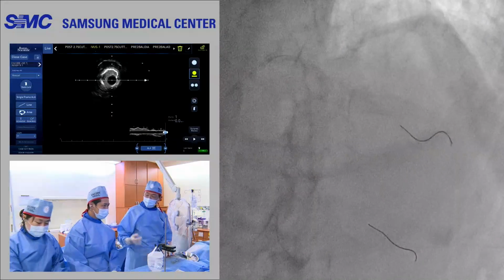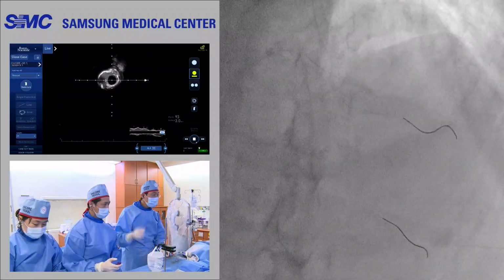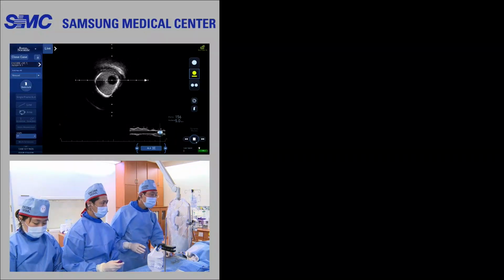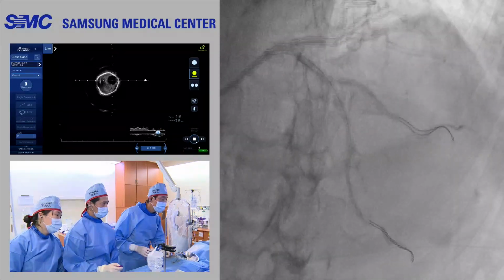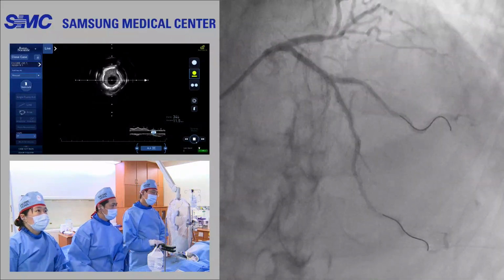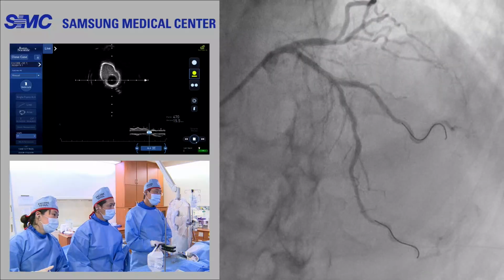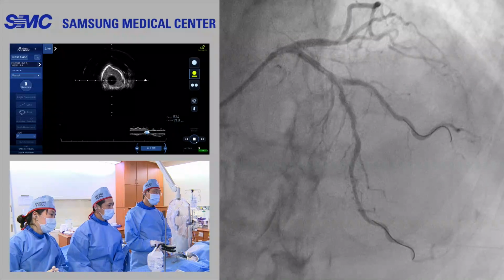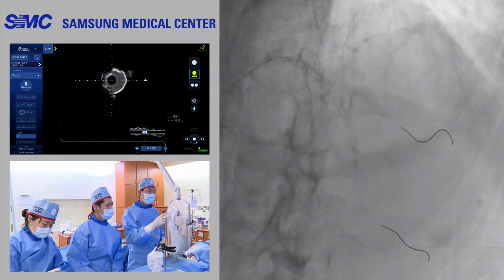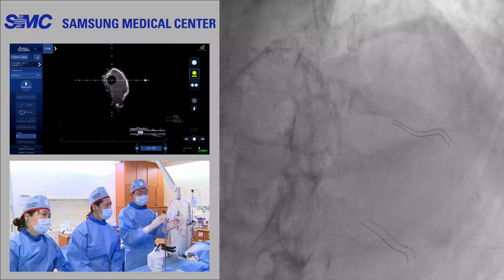Okay? Don't shoot much. Small amount of dye, just push a little. Stop. Okay? Yeah. Quite enough. Not enough. But prolonged DCB can make a better result. But I showed enough room for the LAD, because in this view it is smaller, in another view, different, maybe?